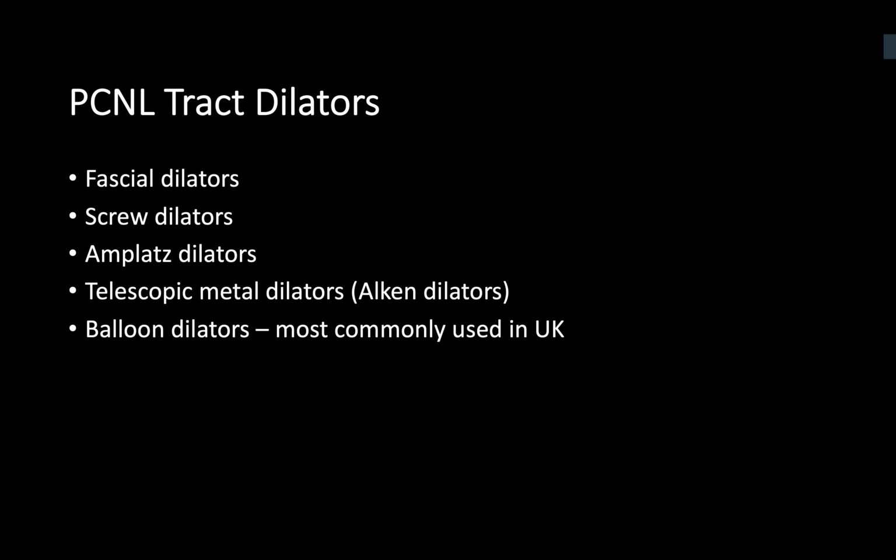Shall I ask you one question? Mr. Dhanasekaran, because most of the time I have heard, even in the Viva mock exams, people give the answer as rigid ureteroscopes. Is it better to say semi-rigid, isn't it?